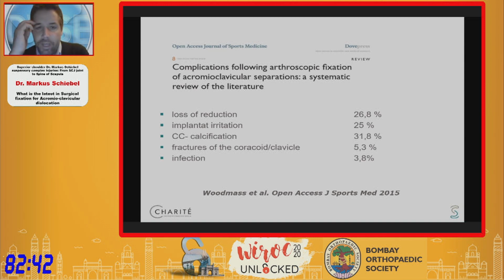What about complications? We know that these fixation techniques, even if you do them arthroscopically, have, I would say, 3 to 4 major potential problems. Loss of reduction, even if you do a perfect job, around 25%, 27%, they migrate up a little bit superiorly or posteriorly. Implant irritation, with the strong fiber wires on top of your plates.